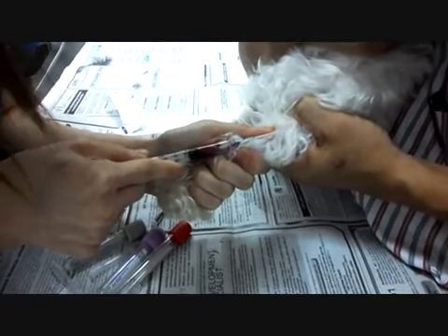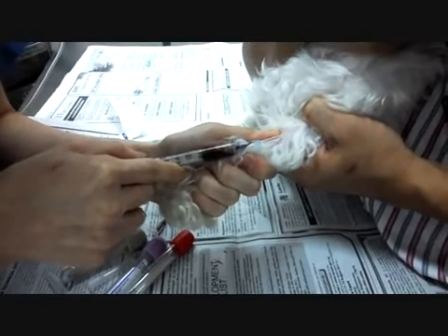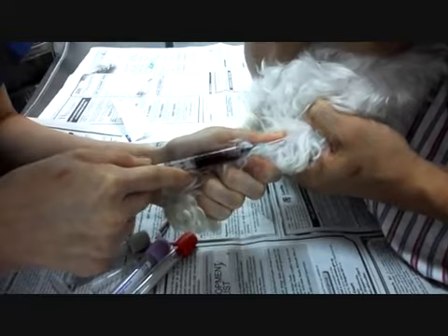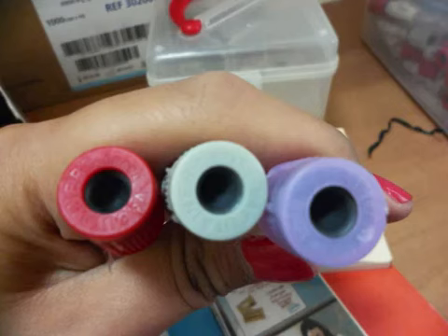The veterinary technician then squeezes the upper forelimb slightly to allow the vein to protrude. Otherwise, a tourniquet can be used. This is done to occlude the blood supply to the vein. The veterinarian is then able to insert the needle to withdraw around 1 to 3 ml of blood. Eventually, the blood collected is divided into 3 tubes: red, grey, and purple.